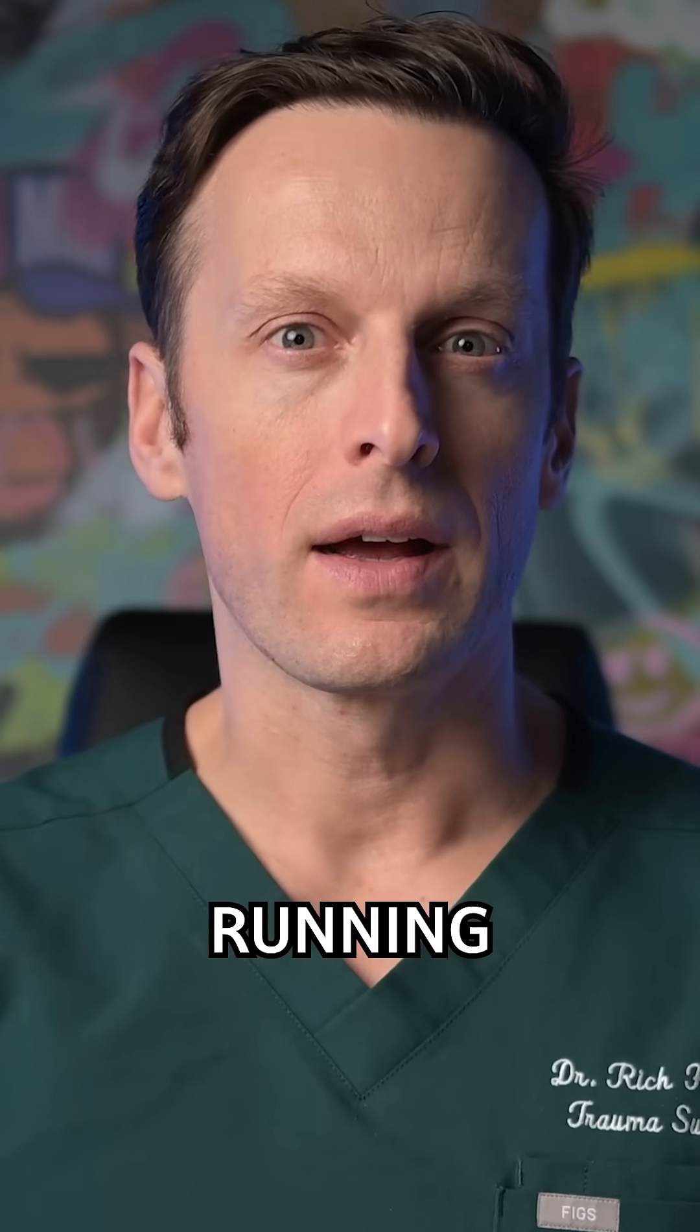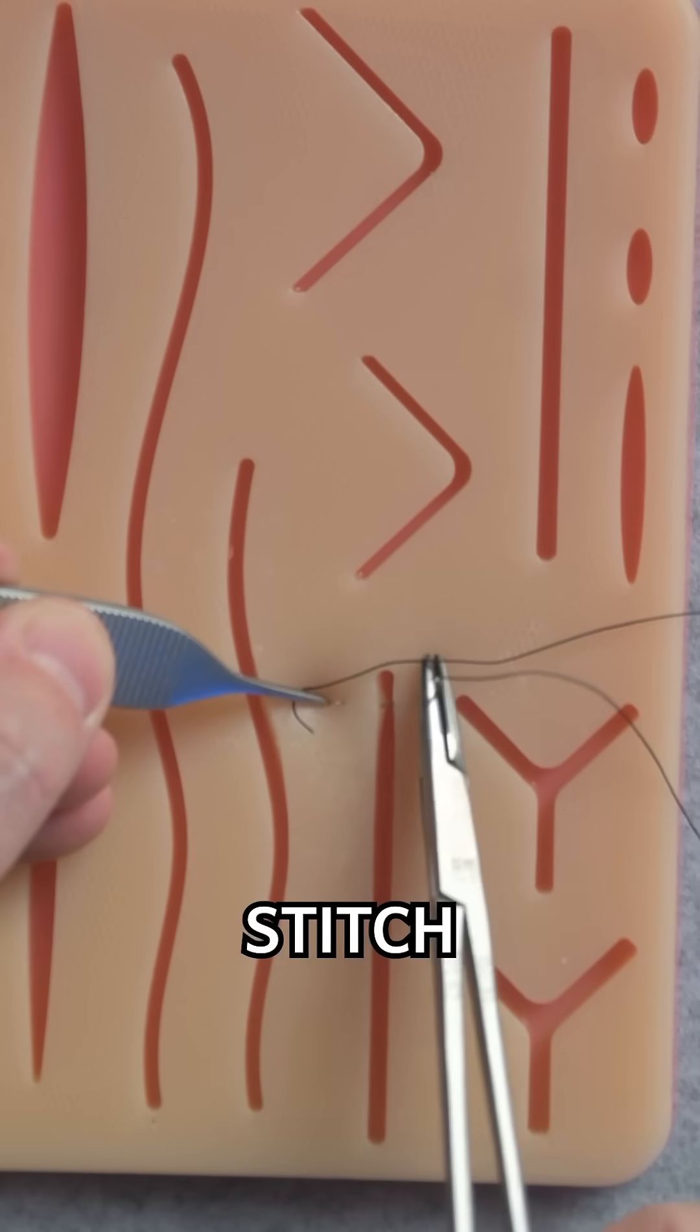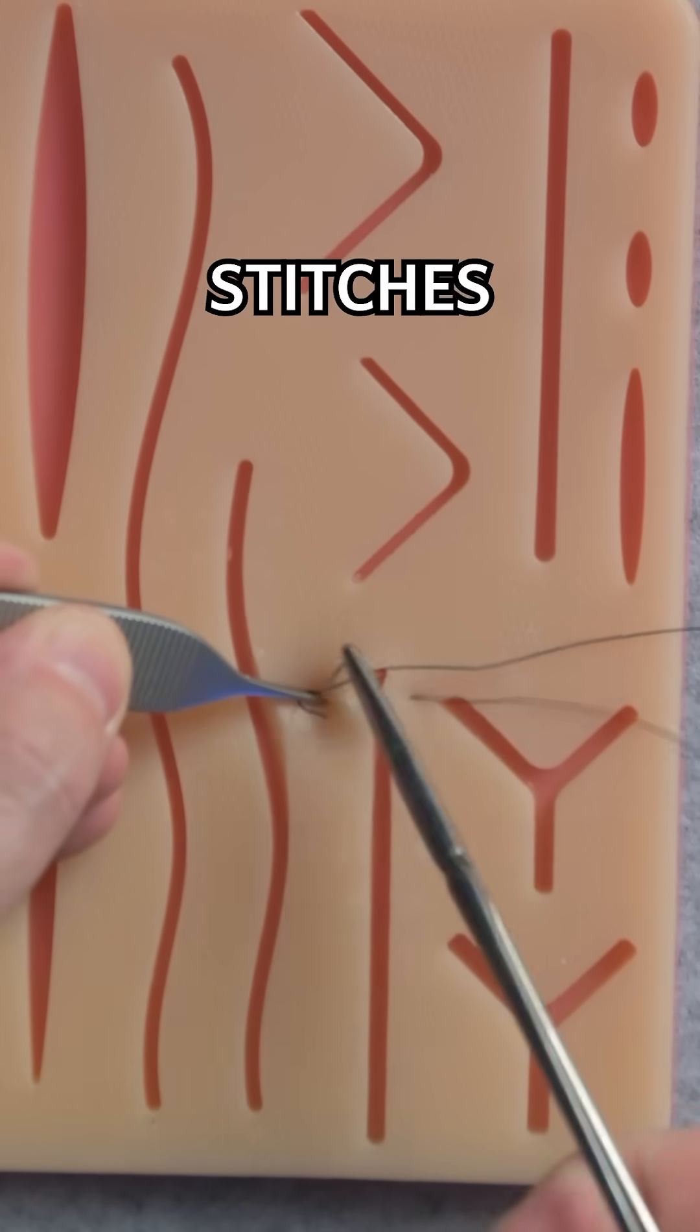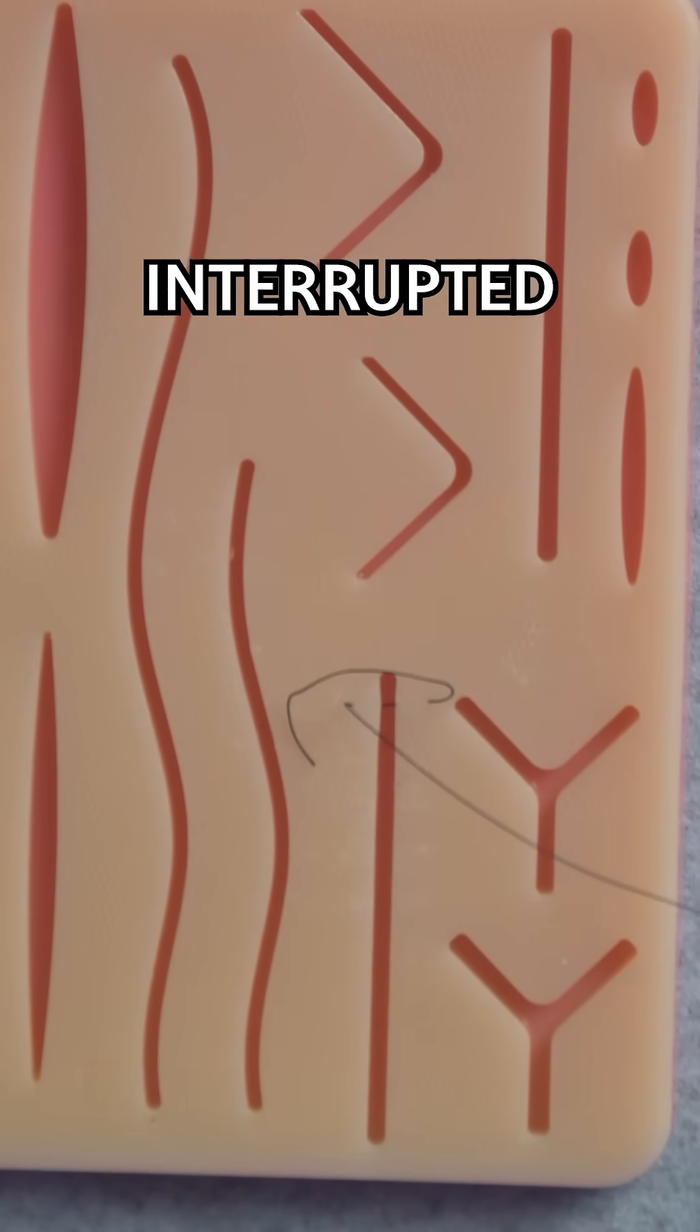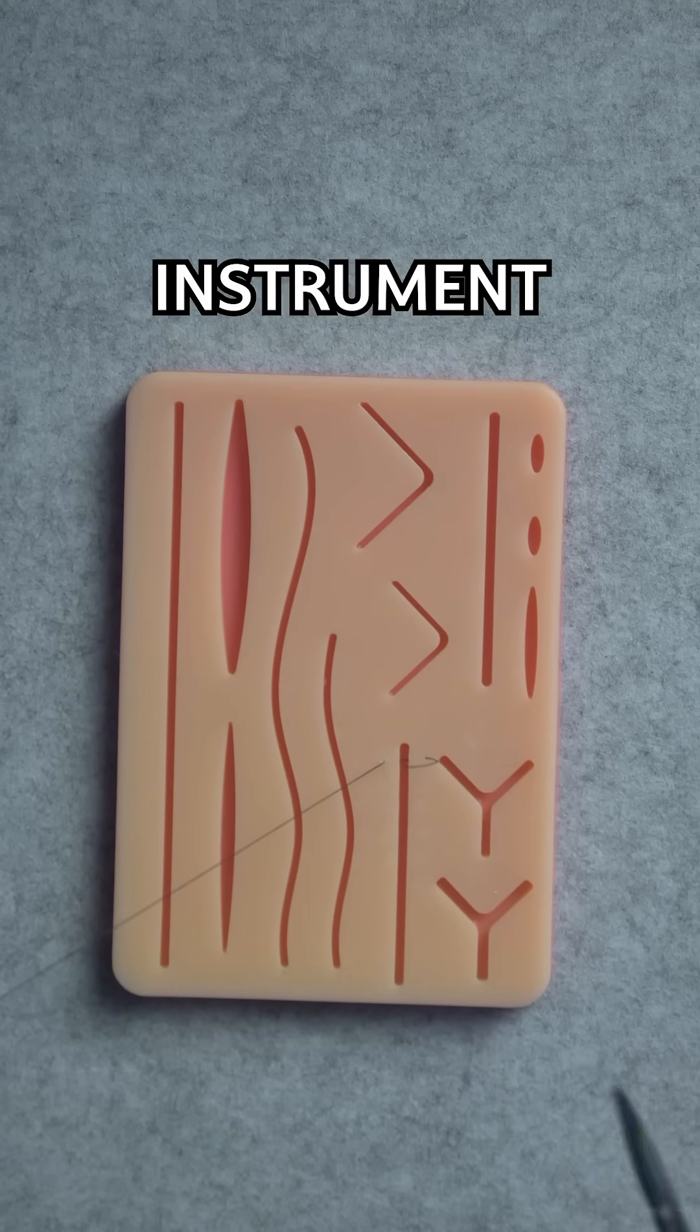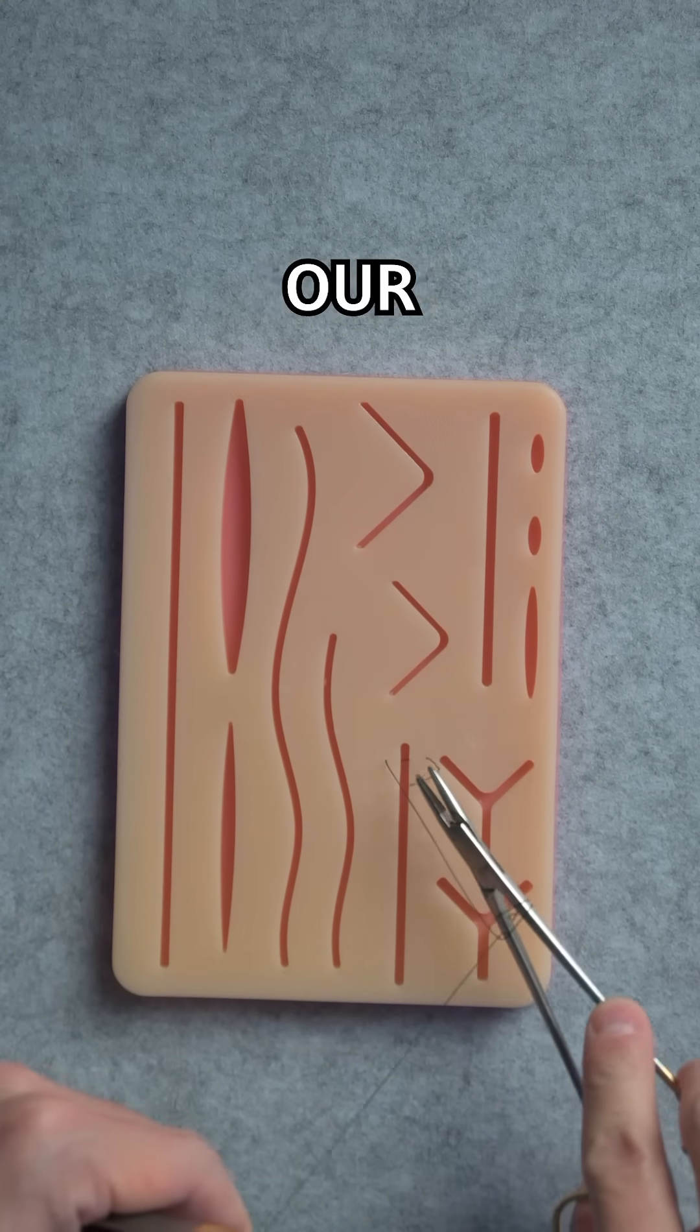Today we're learning the running locking stitch. We start like all of our stitches with a simple interrupted stitch technique. We do our basic instrument tie to start our stitch.